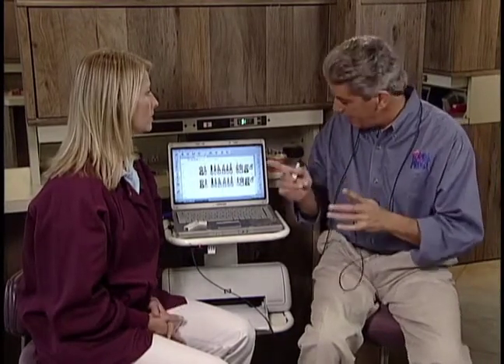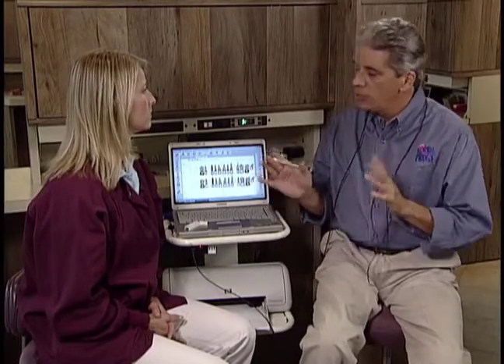Do you feel pretty comfortable with pocket depth at this point? Do you have any questions? What if I make a mistake? Good. There are 4 very common mistakes, and they usually happen in exactly this order.